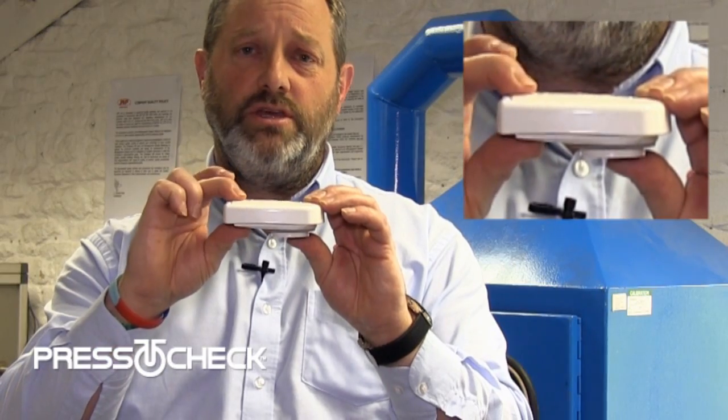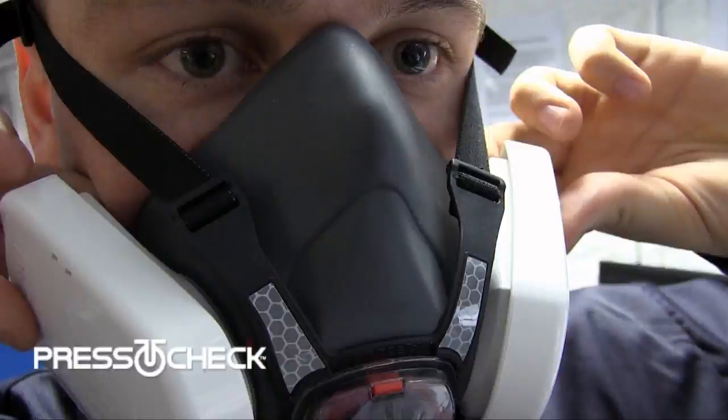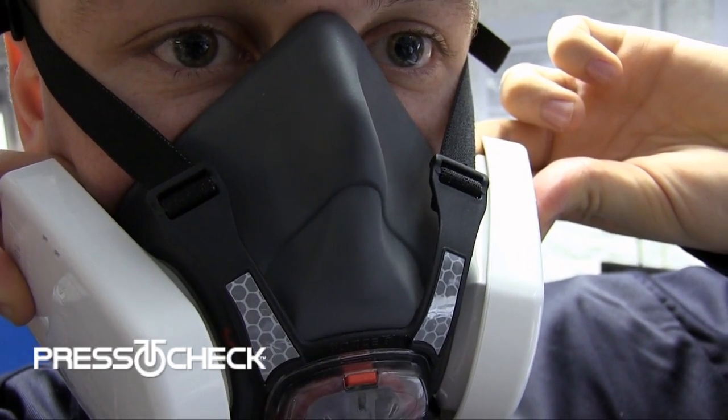What we've done with the press to check filters is make a very simple adaptation to the design to make sure that you can check your mask is working properly every time. To do that, we've allowed the filter to pivot at one end so that as you press it together, you're actually sealing that filter.